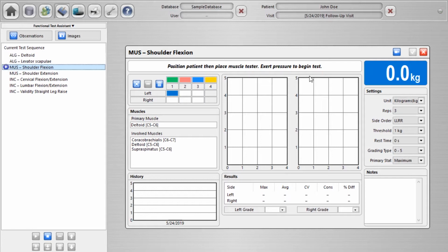Hand muscle strength testing as a practice, for somebody who has a feel for it, even an experienced muscle evaluator. They actually did studies on this in the last 10 years or so, and they found that even an experienced manual muscle tester, using just the feel of the hands, could miss up to a 50% left to right side difference in strength, because the human limb, we just don't have the ability to quantify stuff.